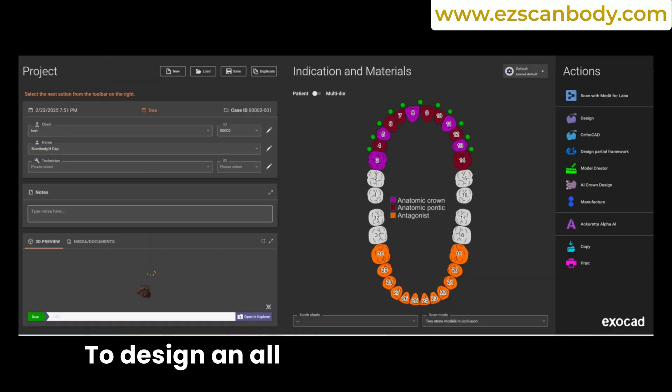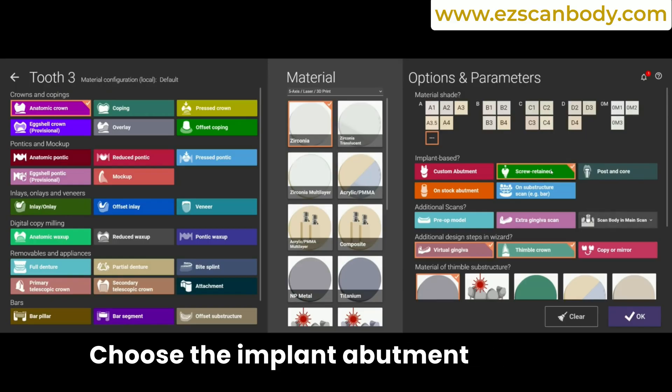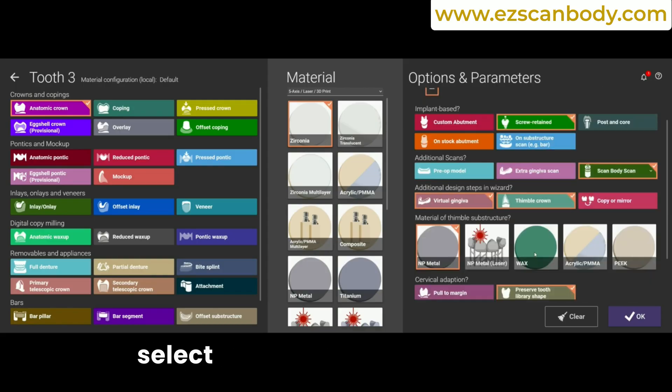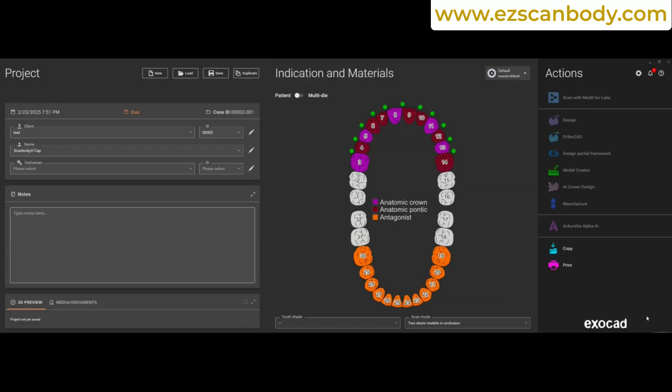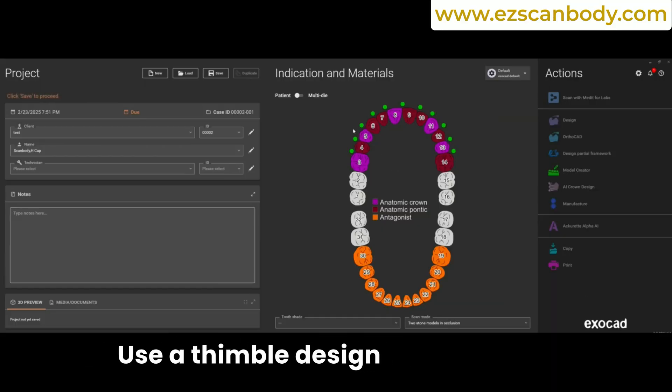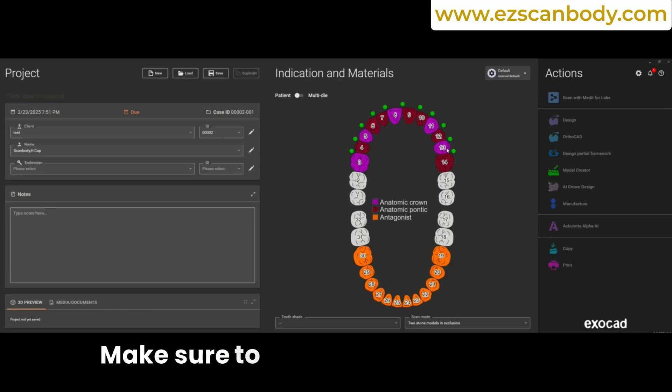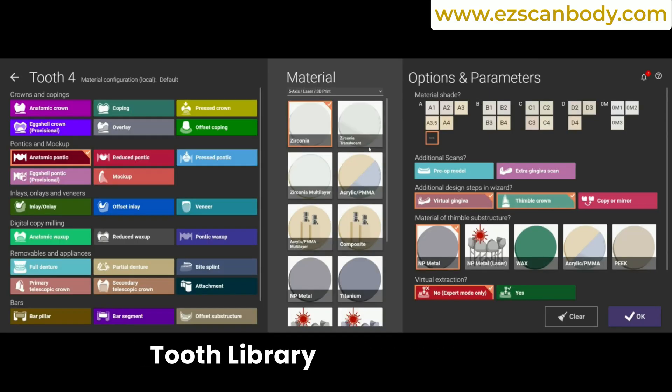To design an all-on-X appliance in ExoCAD, choose the implant abutment as an anatomic crown. In the Options and Parameters, select Screw Retained. Use a thimble design with the Virtual Gengiva option and make sure to select Preserve Tooth Library Shape. Copy these settings to the other implant abutments.